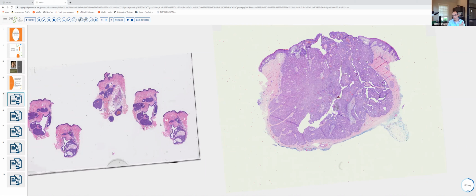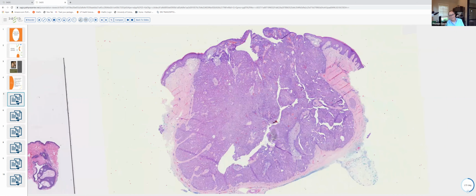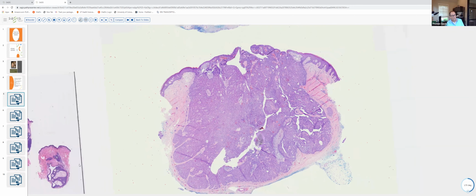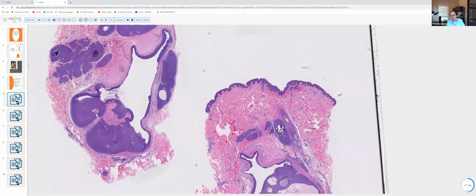So what do I mean by that? Well, rarely, and don't put too much emphasis on this, but rarely one can see a nodular hydradenoma that's composed almost entirely of poroid cells. And sometimes people will refer to that as a poroid hydradenoma. On the other hand, very rarely within a dermal duct tumor or a poroma, one can see clusters of clear staining cells that more closely resemble those seen in a hydradenoma.